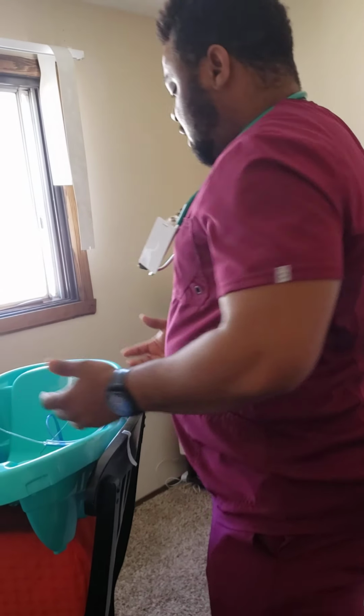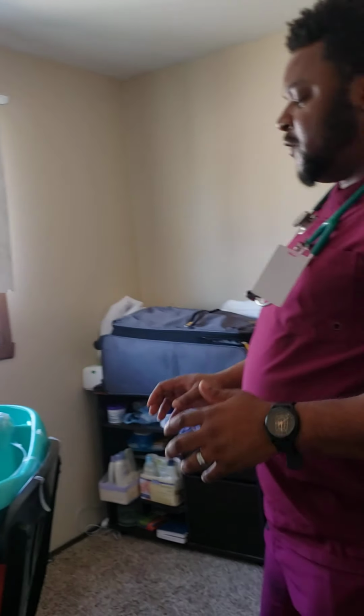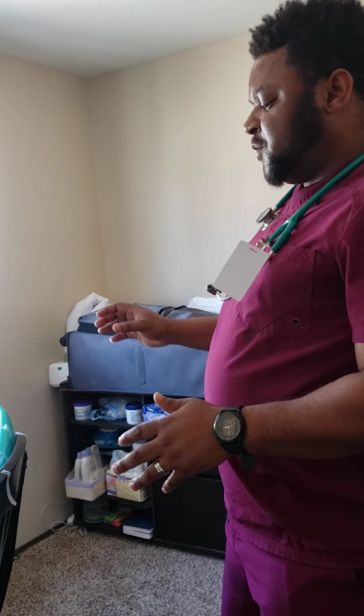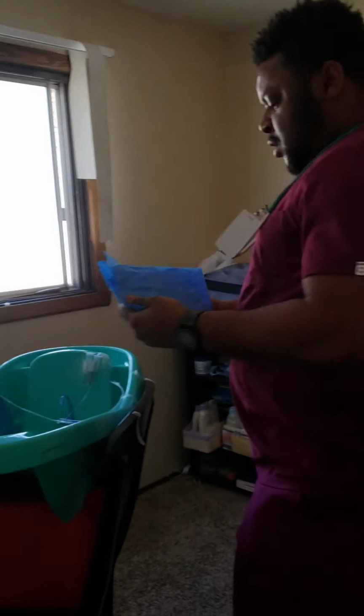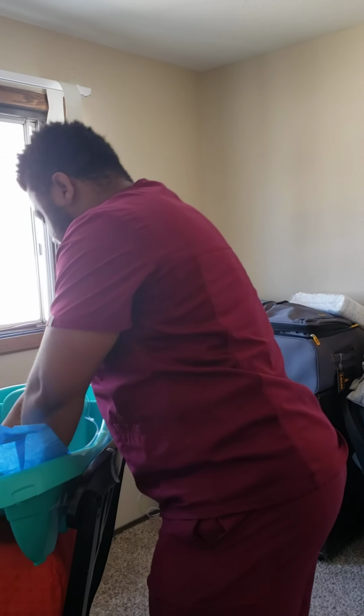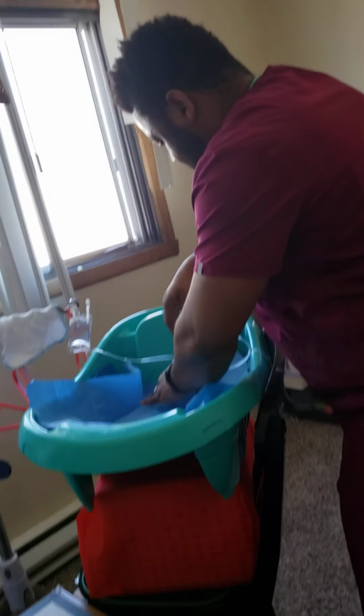So after explaining the procedure to my patient, I'll bring up their bed, put their bed in a comfortable position, and put the patient in the semi-Fowler position. Then I'll want to go ahead and put a drip sheet right underneath the patient, right there.